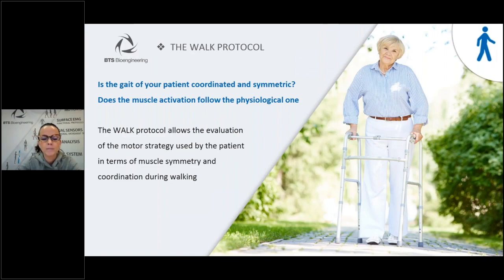At the same time, the protocol is also part of the patient's follow-up, demonstrating with quantitative and objective data the benefit of the applied rehabilitation treatment.